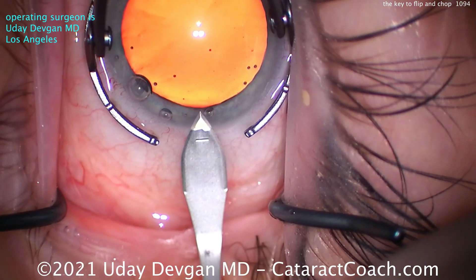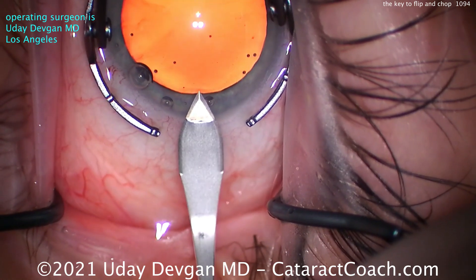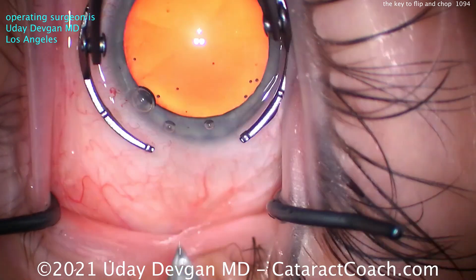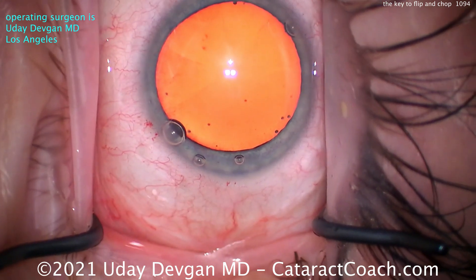Here's the main FACO incision using the steel keratome. Nice single plane, good tunnel length. Very square, good tunnel length. Nicely at the limbal vessels — that's a good incision.